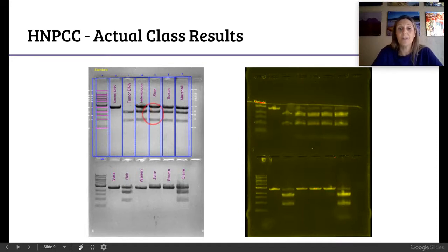And then here are all these different individuals, and I put their names in, but you'll see when you go through the manual, these are the simulated names from that family. And so then the kids can start to fill in their pedigree with these individuals' genotypes, and see if that matches the inheritance pattern that they thought they were going to get from the pedigree that they made previously. So this lab is pretty reliable.